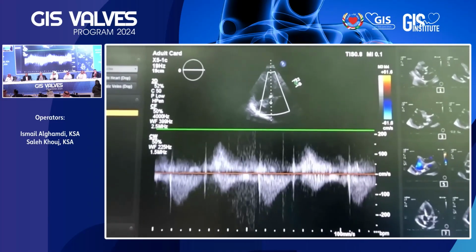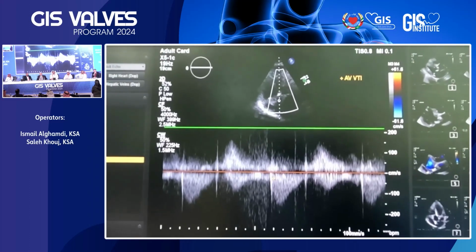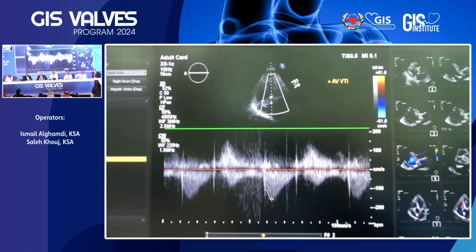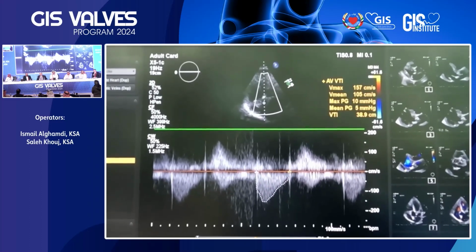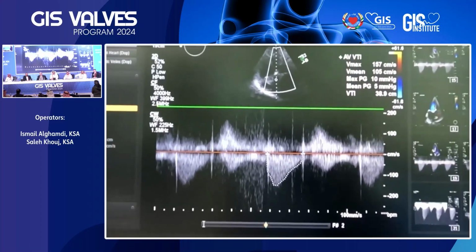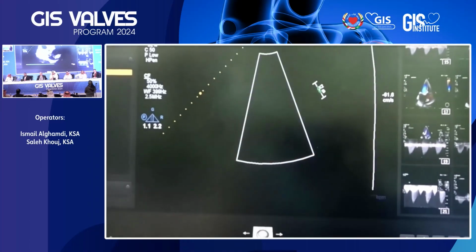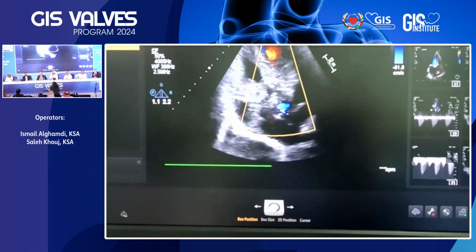Dr. Faisal, as they're doing this, just a quick question. I would like to hear the opinion of the panelists in terms of the depth. Like we can see there is a zero degree. As an expert panelist, would you go for that kind of depth, or would you like at least 3 millimeters below? Just like to hear your insight from all the panelists. Great.